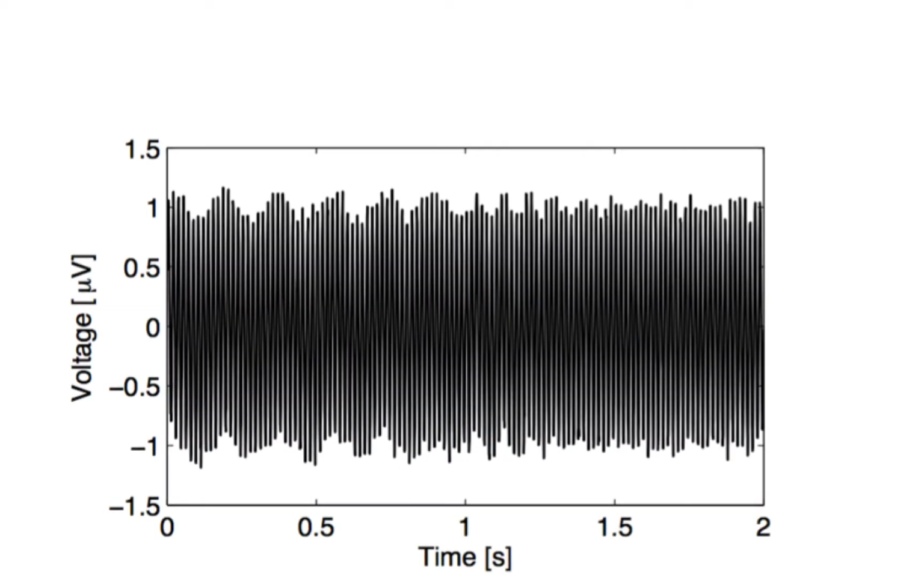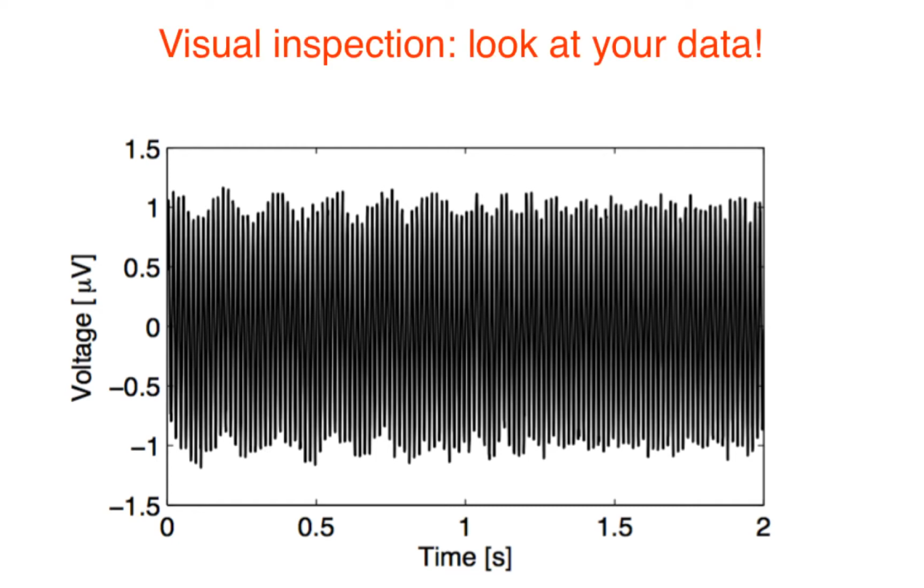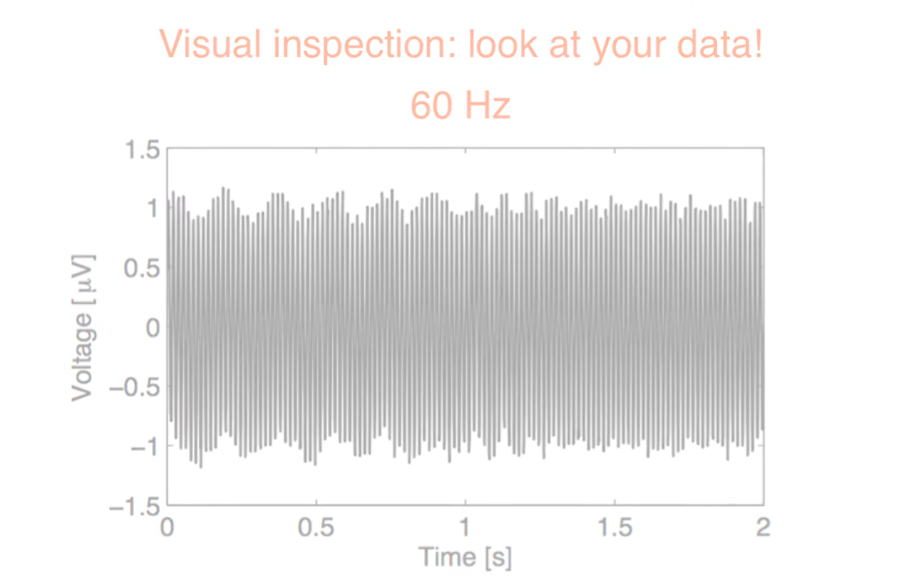In this module, we analyzed 2 seconds of EEG data. We started with visual inspection of the EEG time series. This is always the best place to start when analyzing new data and provides some important initial intuition for the time series. Through our initial visual inspection, we concluded that rhythmic activity appeared and was dominated by a 60 Hz oscillation. Then, to characterize further the rhythmic activity, we computed the spectrum.